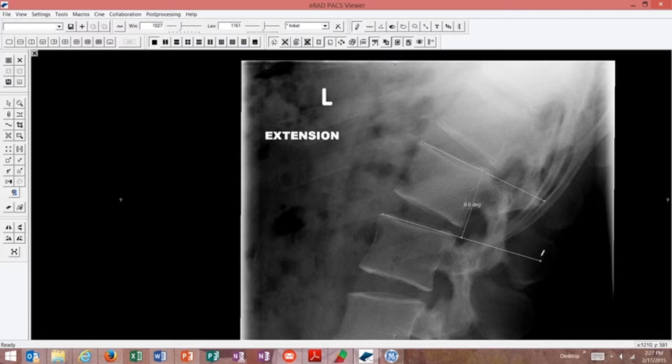On our flexion angle, we had an angle of positive 3.9. So when we move from positive 3.9 to negative 9.6, well, that's a movement of approximately 13 degrees through which that vertebra has moved. And we'll demonstrate how to report our findings in just a moment.